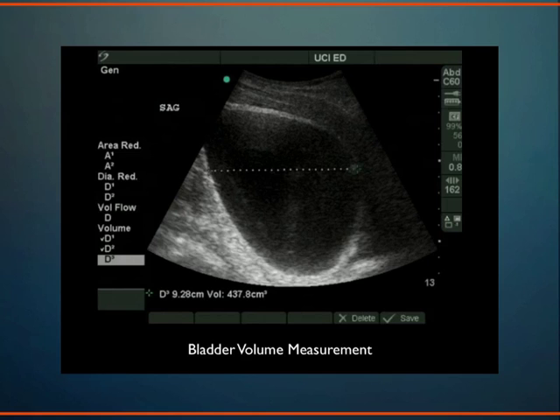It's something that we want to know about actually quite frequently in the hospital, because at all ages. In little babies who have a fever, we want to basically cannulate their bladder, put a catheter in their bladder to get the urine out, to send it off for urine culture. Well, some of them just urinated in their diaper, and you would unnecessarily put them through the procedure of a bladder catheterization, which is painful. So you could avoid it unnecessarily, you have to wait until the bladder fills up, basically. So I train my nurses to do this, and they take a peek at the bladder before they bother putting a catheter into a small child.